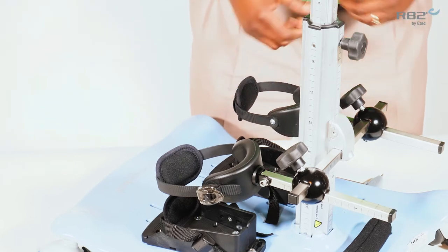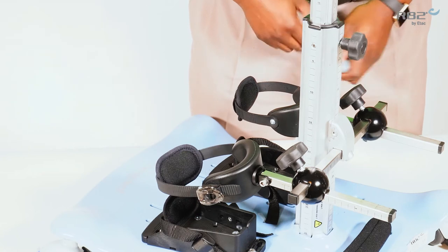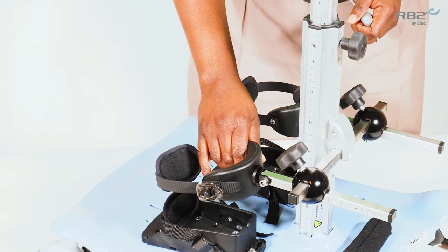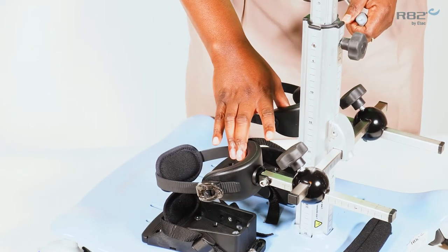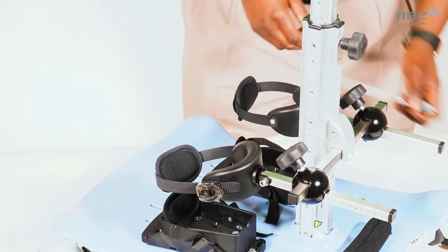The second width adjustment is done by a bilateral adjustment. This will allow the knee supports to be adjusted together without changing the measurements between the knee supports.